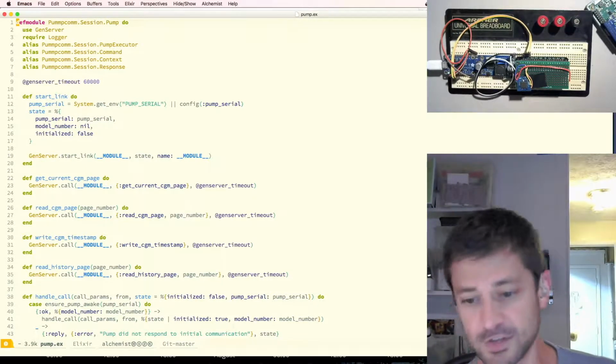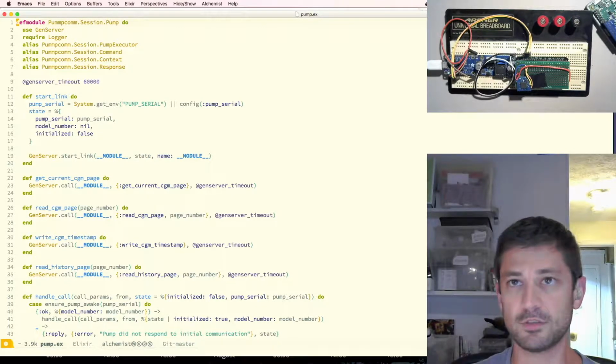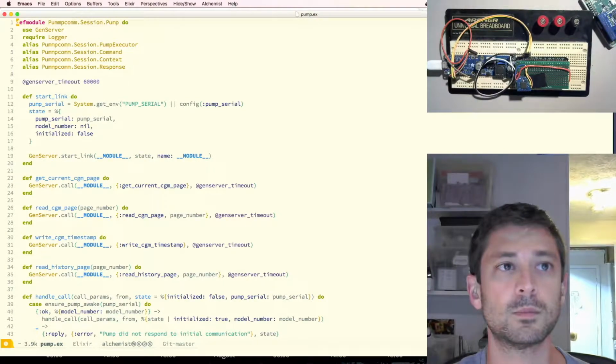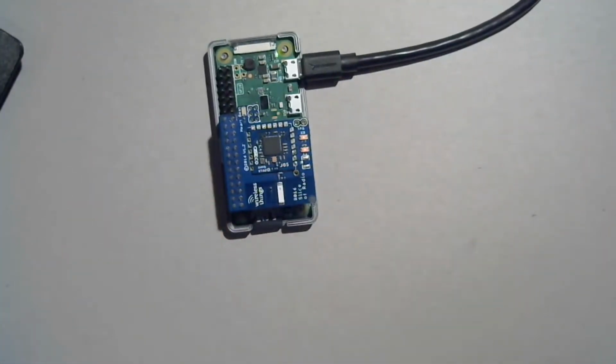So overall architecture of this application is pretty simple. At the very lowest level, there's a UART, a serial connection to this chip right here. Let me just switch over to the desktop. So at the bare bones, what you're looking at is basically just a serial connection to this chip on top. And the Raspberry Pi Zero, when it boots into the Nerves firmware, just starts talking to this chip. And it happens to communicate at the same frequency as the insulin pump. So when it's all said and done, it knows how to communicate at 916 megahertz and wake the pump up and do all kinds of fancy things. Much more fancy than the get time and date thing I'm trying to do tonight.